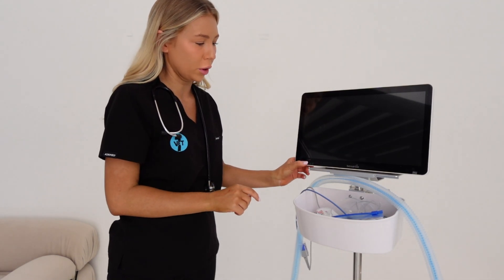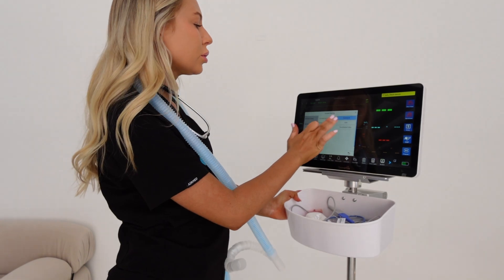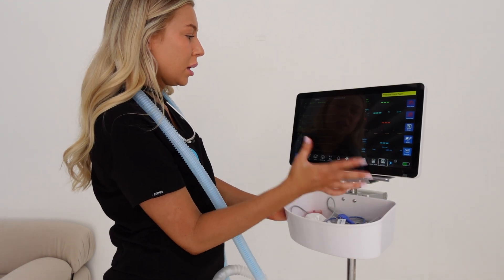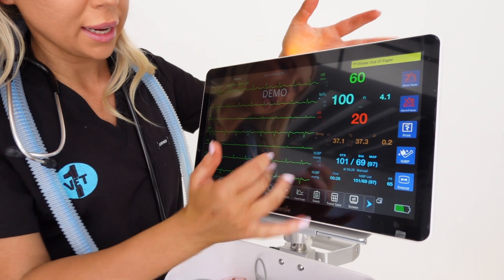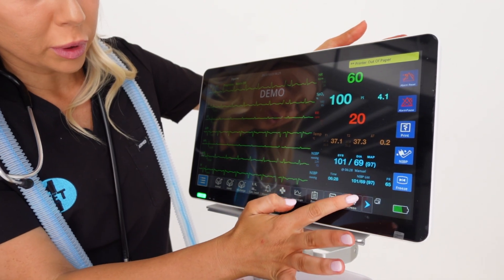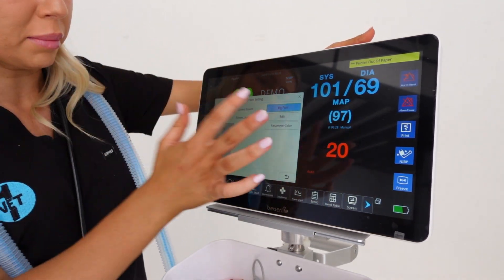Like the Iris, this one has no buttons - it's completely touchscreen with just one button for on and off. The view on it is amazing. Looking at the different screen options: the current screen is standard. ECG full screen - so if you had a heart patient needing a full ECG trace to record, how cool is that. You've got full ECG, heart rate, SpO2, respiratory rate, temperature, and blood pressure. You can also go to big font mode if you have trouble seeing.